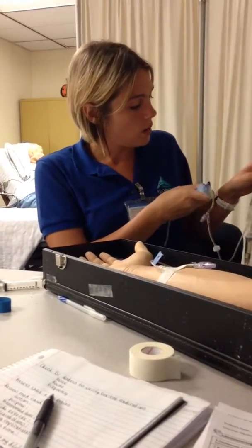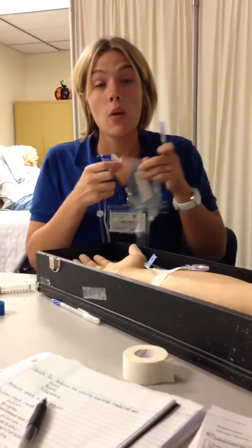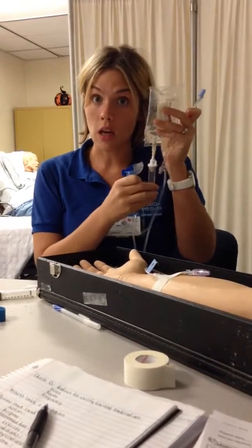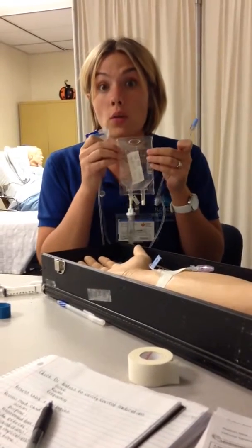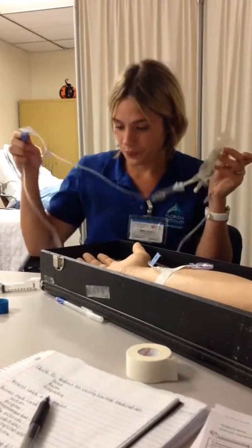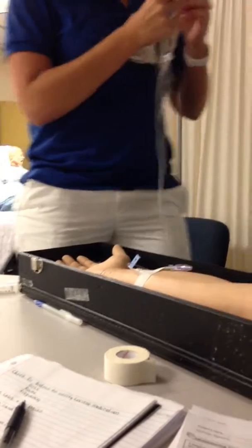Okay, it's primed. Now I need to label my tubing with my initials, the date and time, because this tubing can be used again within the correct time parameters. I also have a label on my medication so that I know that I have the right patient, the right dose, the time, and I'm going to go ahead and go into my patient's room now.